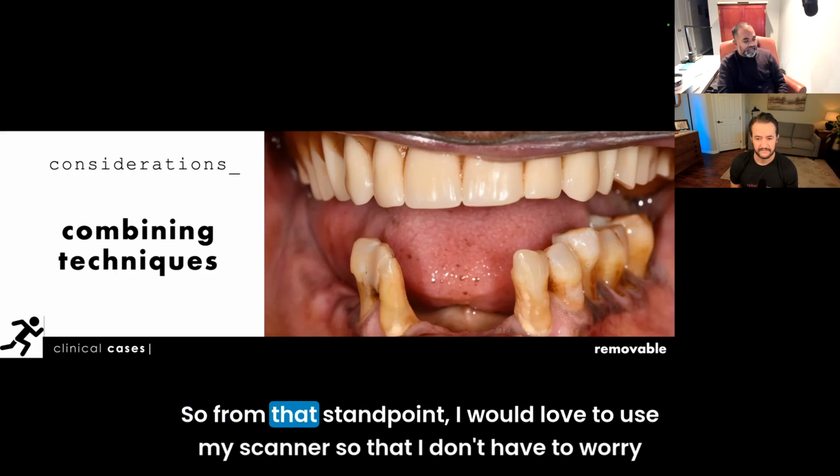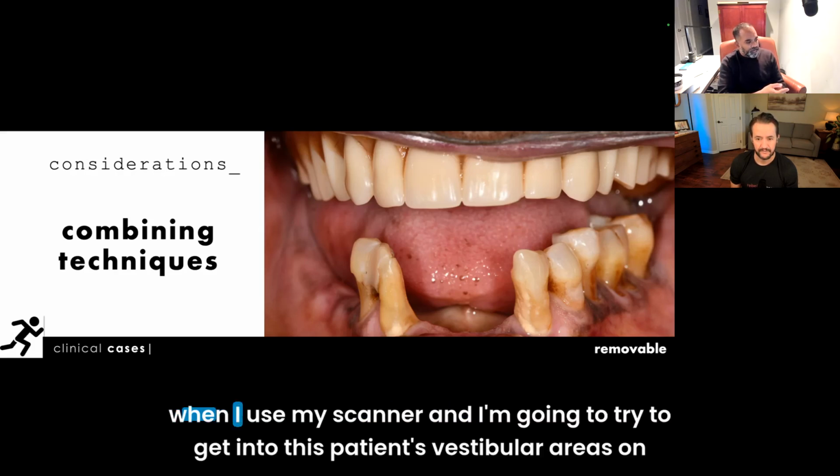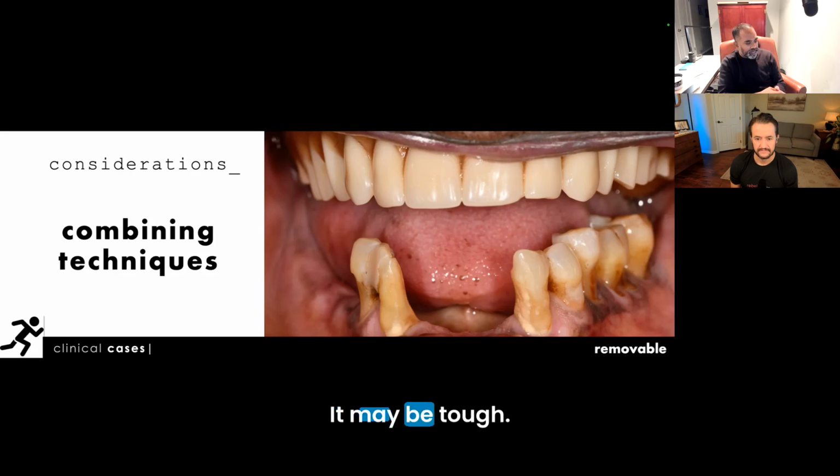So from that standpoint, I would love to use my scanner so that I don't have to worry about all of those challenges with managing the open embrasures at the gingival aspect. But when I use my scanner and I'm going to try to get into this patient's vestibular areas on the lower right, I may have some challenges. It may be tough.